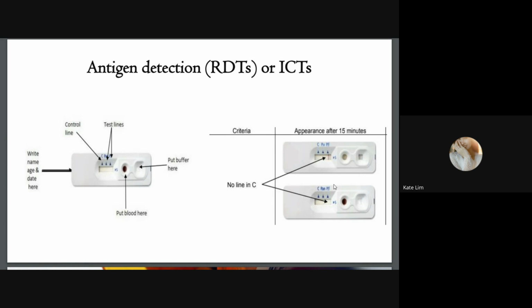That would only mean that you need a medtech to distinguish kung unsa jud ang sakit sa patient. So, if the lines are found in C, PAN, and PF, lines C and PF, this would suggest mixed infection. So, meaning more than one species of malaria parasite is present.